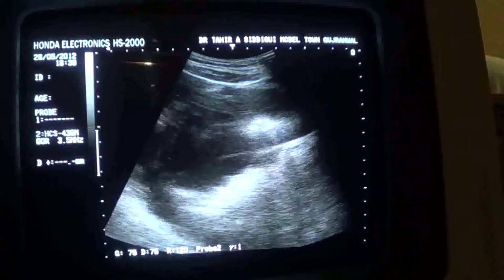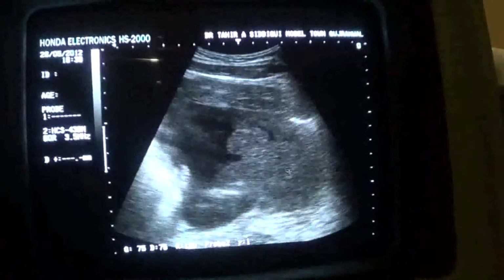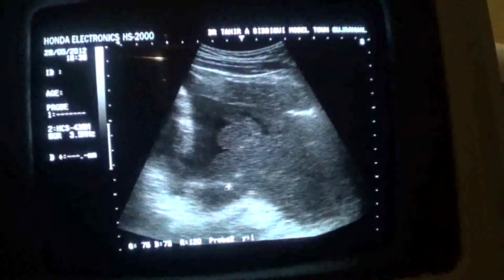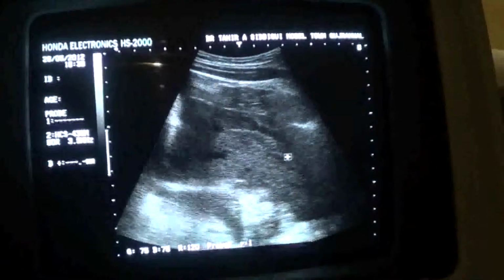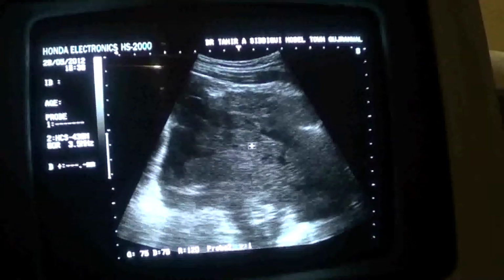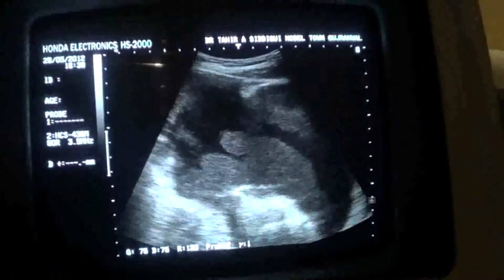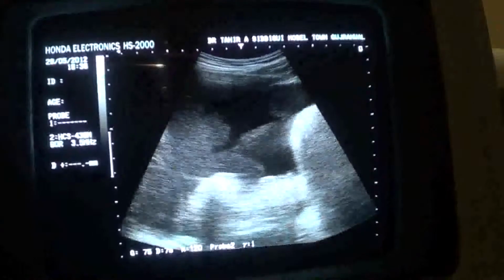So the patient is bleeding internally, though by ultrasound parameters almost all structures are within normal. No rupture of spleen, liver or kidneys is seen. So he will have to go through exploratory laparotomy immediately. This is the typical picture of bleed, with bowels floating in a clear fluid as well as within this bleed.